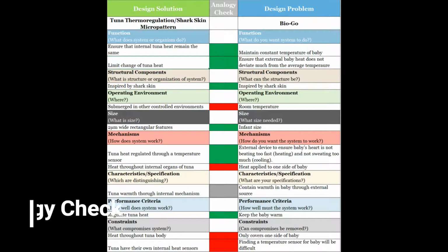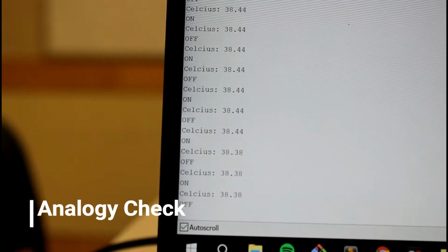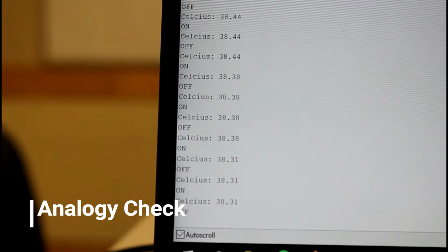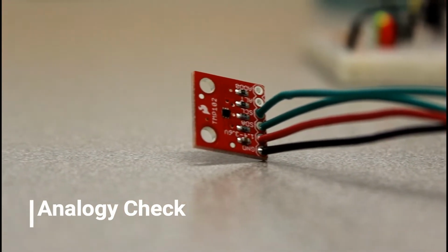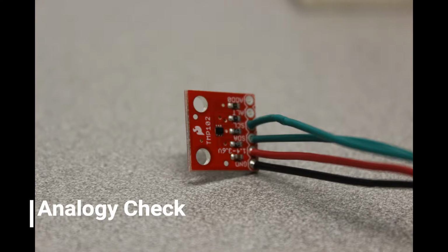The primary biological inspiration utilized by the IncuMat is the thermoregulatory abilities of tuna fish. Tuna fish are able to ensure that their internal temperatures remain stable by limiting the fluctuation of their body heat. This function is translated into the IncuMat, as the mat maintains the baby at a constant temperature and ensures external heat does not deviate too far from the average temperature. Both tuna fish and the IncuMat work through temperature sensors. The IncuMat ensures that the baby's heart is not beating too fast, causing overheating, and that the baby isn't sweating too much, which would cause excessive cooling.